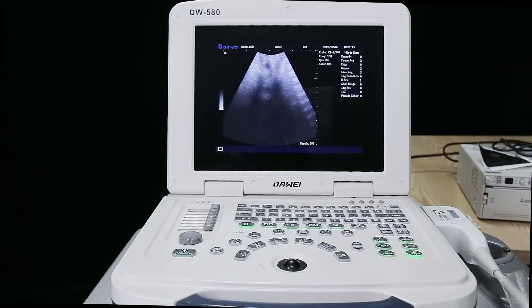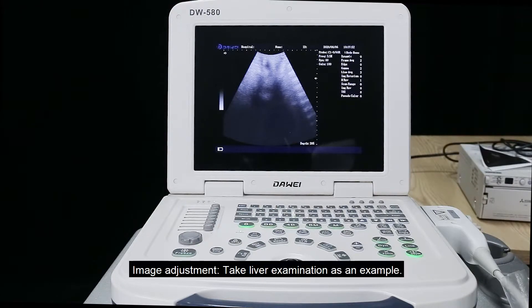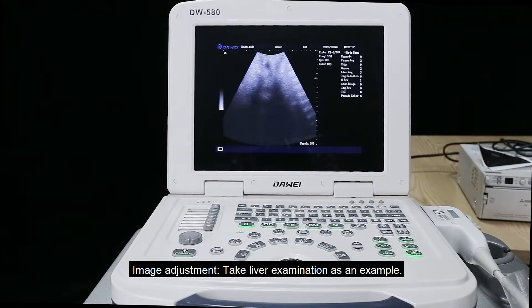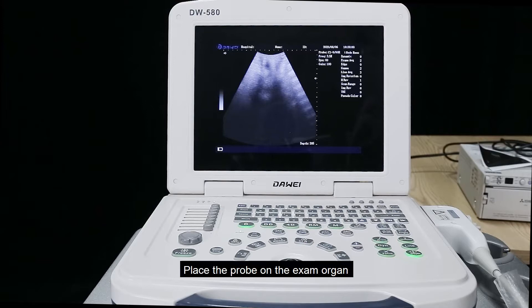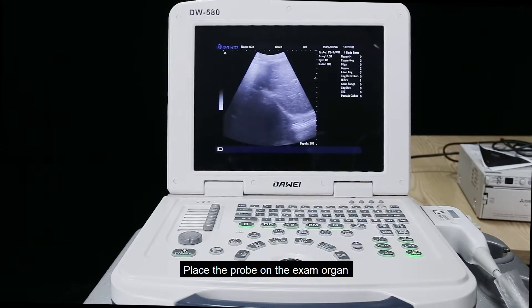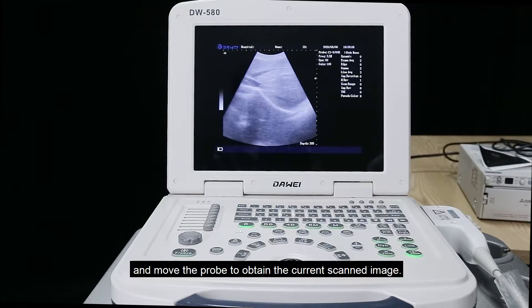Third, demonstrate how to adjust the parameters of the machine to get a clear image. Image adjustment. Take liver examination as an example: place the probe on the exam organ and move the probe to obtain the current scanned image.